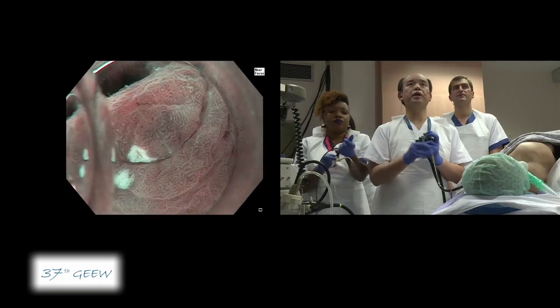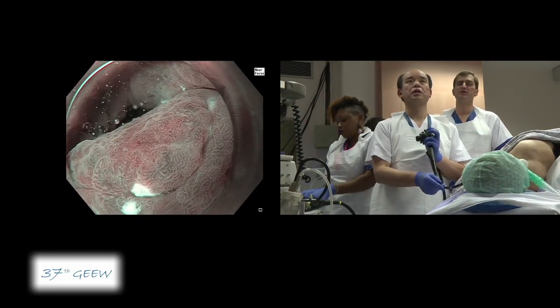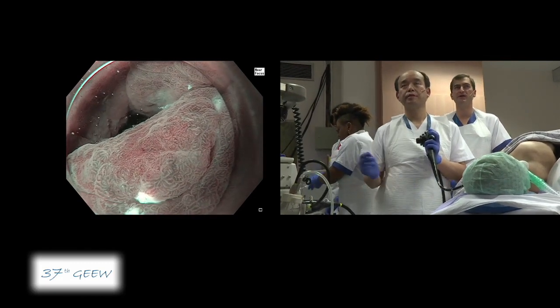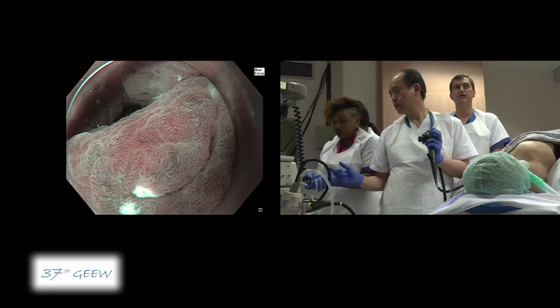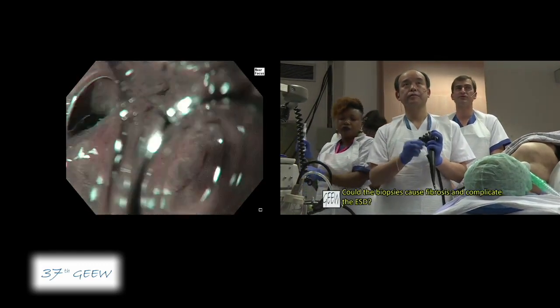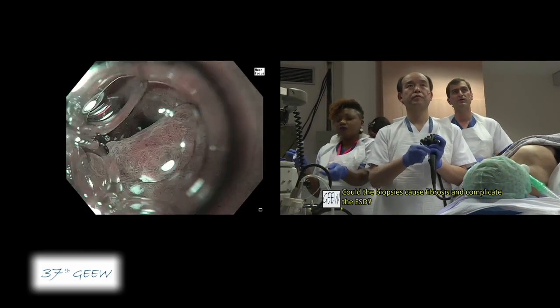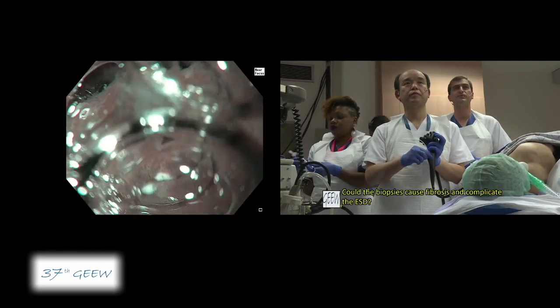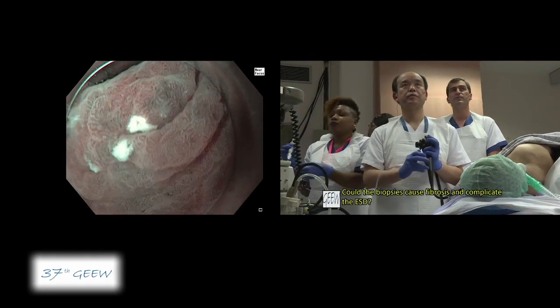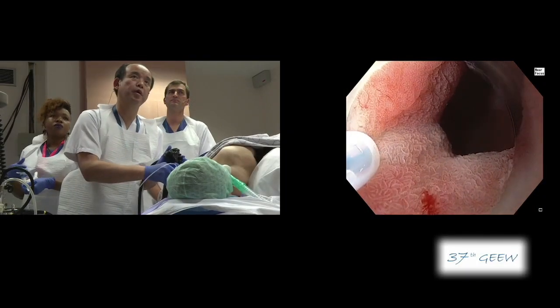Now this is a good message for the audience about the indication. ESGE has published new guidelines about the management of early gastric neoplasia. In the new guidelines, if it is only low-grade dysplasia in your biopsy but you have a visible lesion that looks suspicious, it is an indication for resection — because when you analyze the specimen there is an upgrading of the dysplasia stage or cancer compared to the biopsy, due to sampling error. Yes, that's right. Injection please.